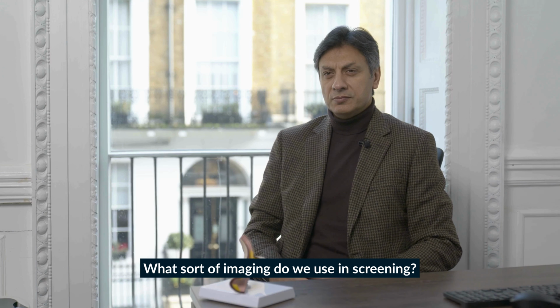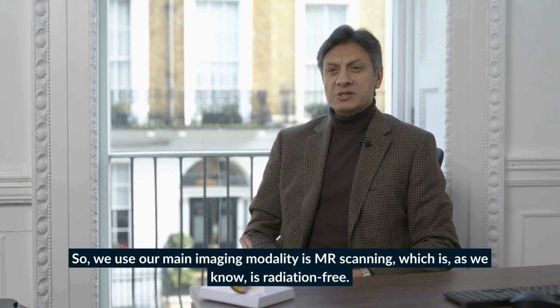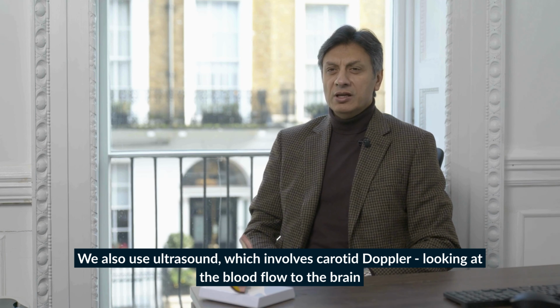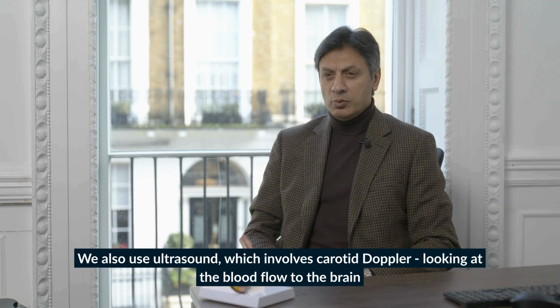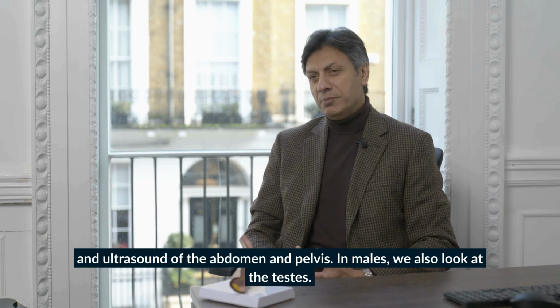And what sort of imaging do we use in screening? So our main imaging modality is MR scanning, which is, as we know, radiation free. We also use ultrasound, which involves carotid Doppler, looking at the blood flow to the brain, and ultrasound of the abdomen, pelvis, and in males we also look at the testes.